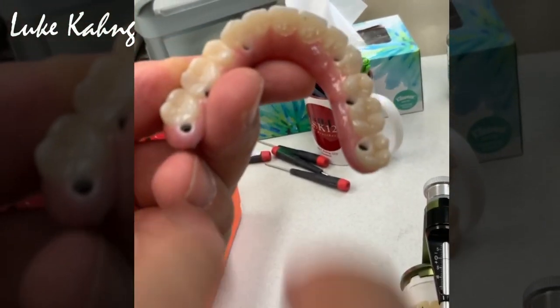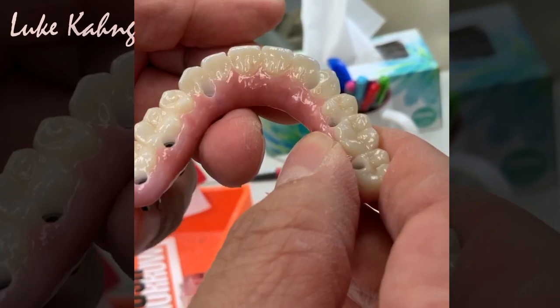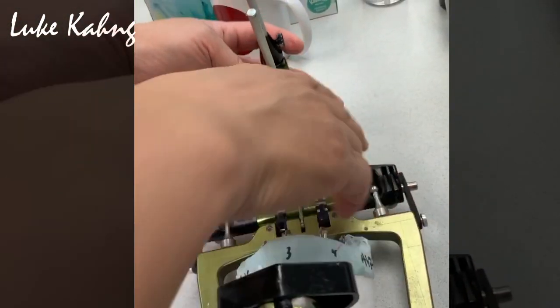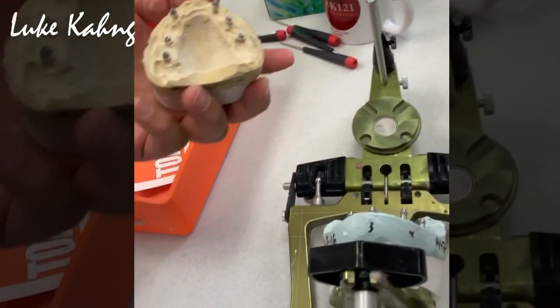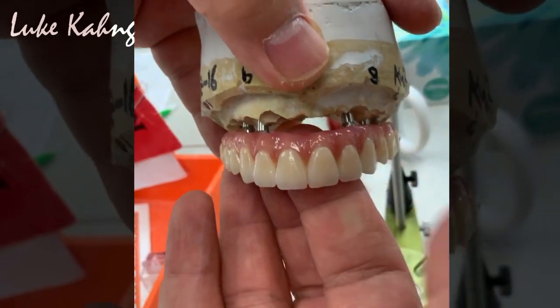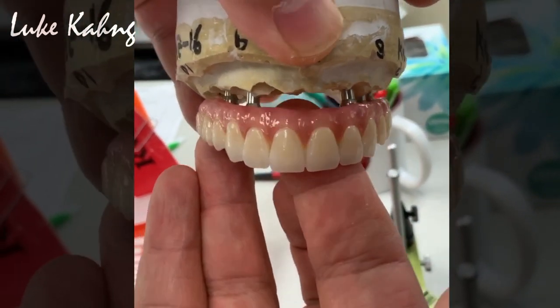Alright, so this is all mono here. Okay, so this is all mono. And then here is mounting. Just make sure they seat all the way. This here.